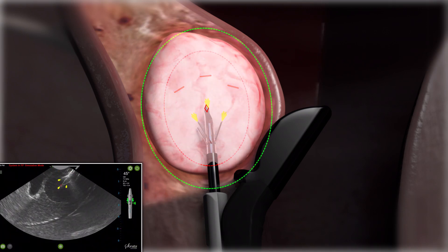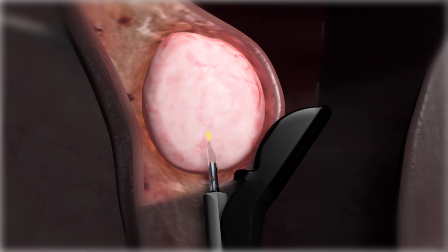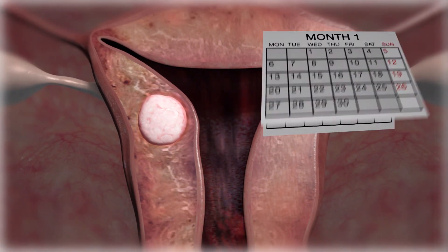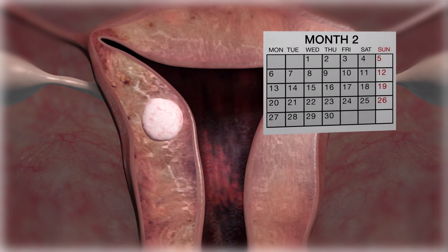The needle electrodes and introducer are retracted to allow for additional ablations or removal of the treatment device. 50% of women return to normal activity by the next day. The ablated fibroids shrink over time, and most women experience a reduction in symptoms and heavy menstrual bleeding within 3 months.